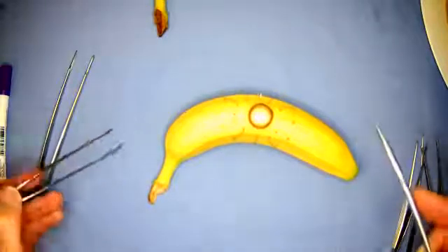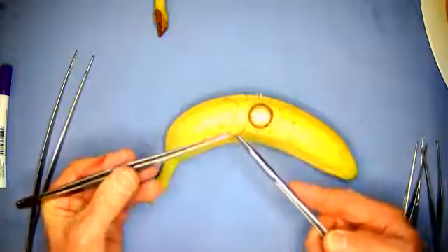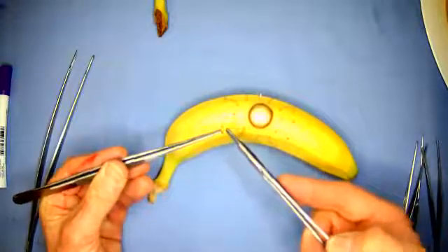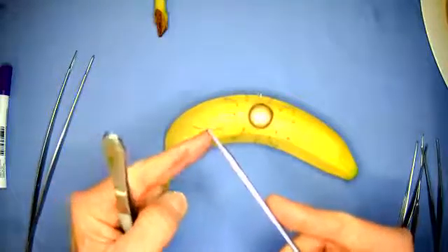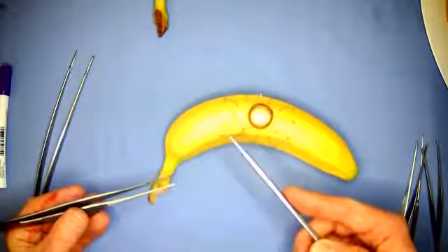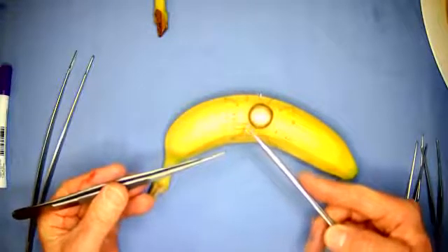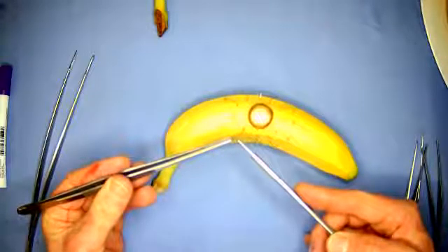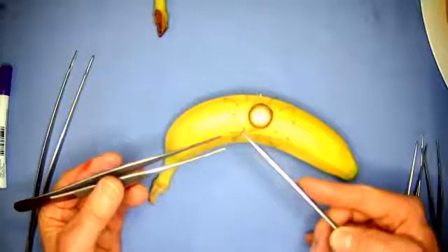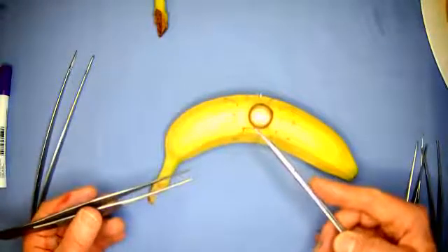Our forceps are there to retract and hold tissues. I'd not advocate delivering the needle with your forceps because you'll interrupt that position, as we've discussed before. The tissue holds the needle, and only in rare circumstances do I hold the needle to stabilize before picking it up. I usually find that when I'm doing the right coronary anastomosis because there's no tissue on the outside.